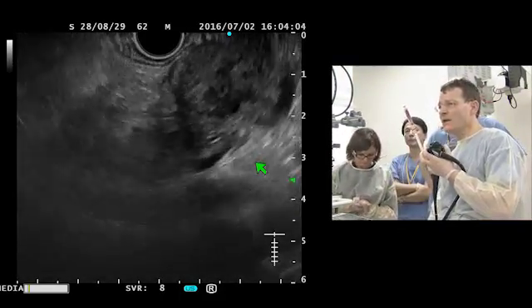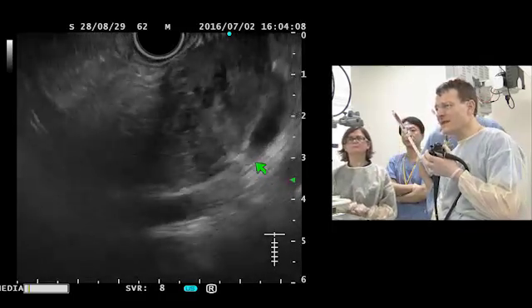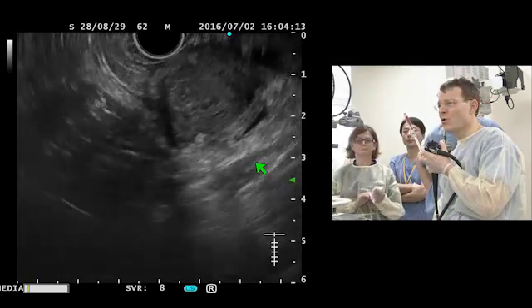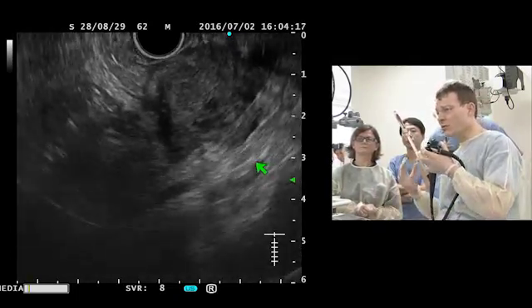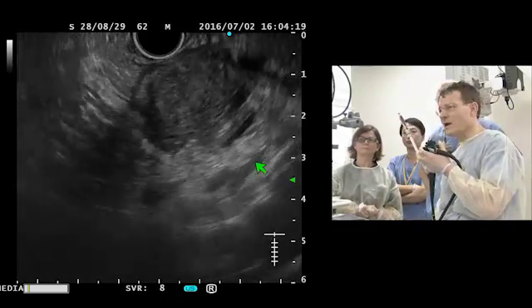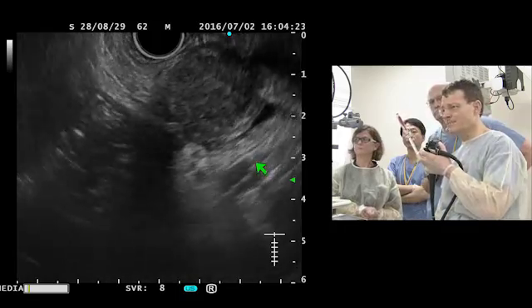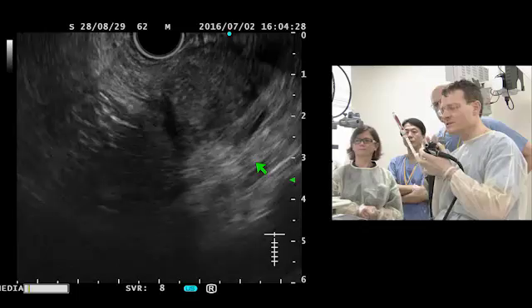And now, what we have noticed before, this tumor has part of liquid components and there are more solid components. The solid components are here more in the area of the pancreatic tail. So my primary goal is to get in this area where we have more solid material. Now, what I'm doing now is I use a continuous suction.